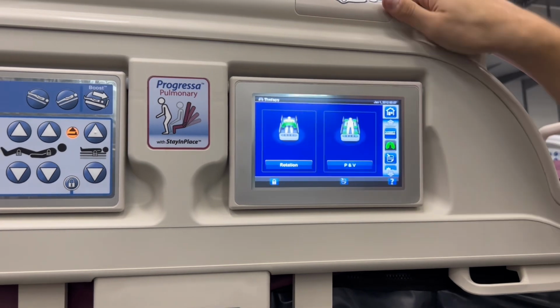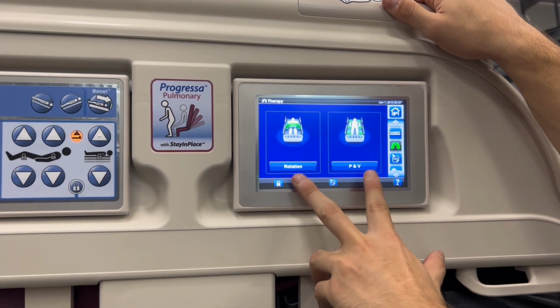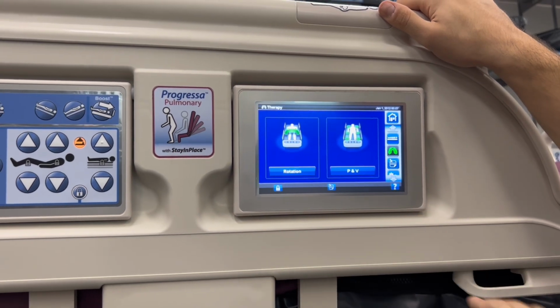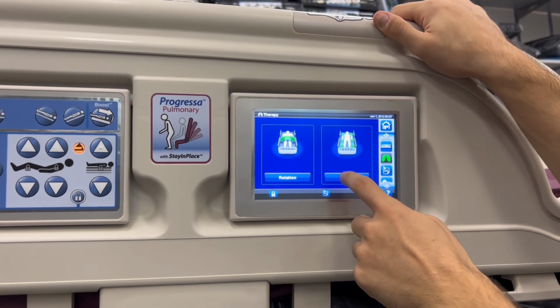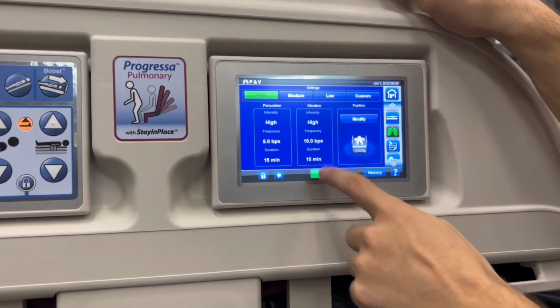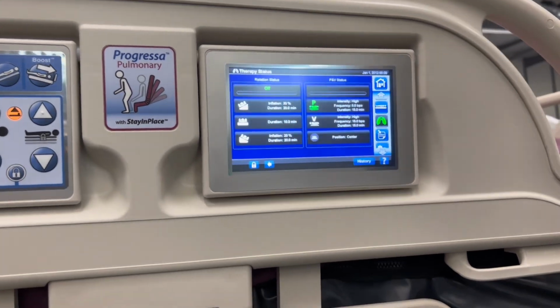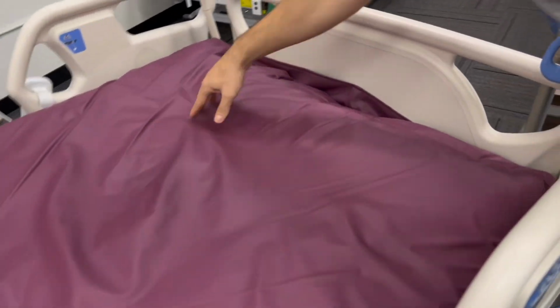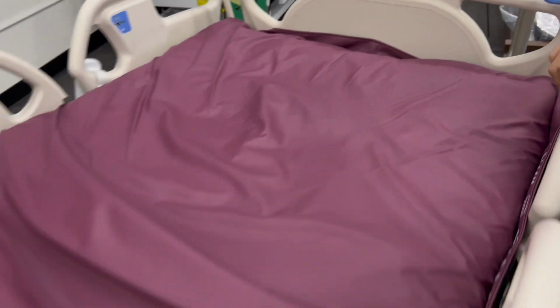If we keep going down over here, these are going to be the two therapy functions. So this bed offers both rotation, where it's going to turn you side to side and rotate your body, as well as percussion and vibration. So if we turn these on, what you're going to see is towards the top here, the bed itself is going to start both percussing and vibrating.